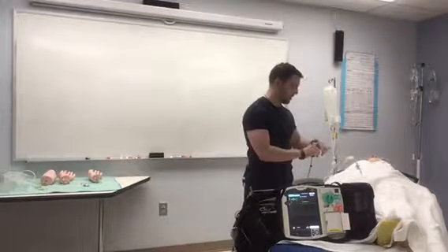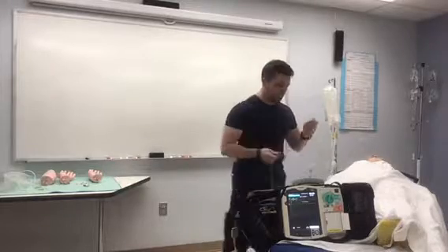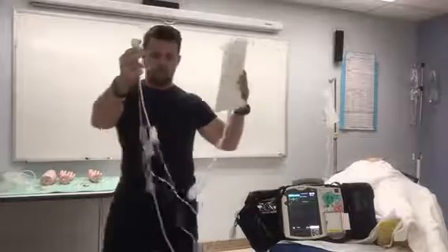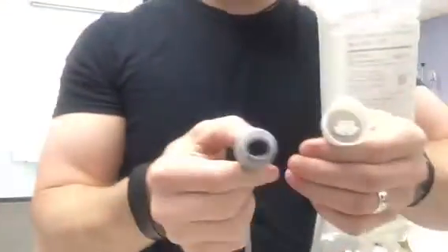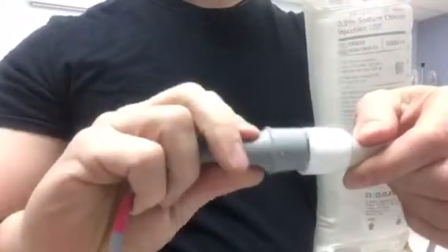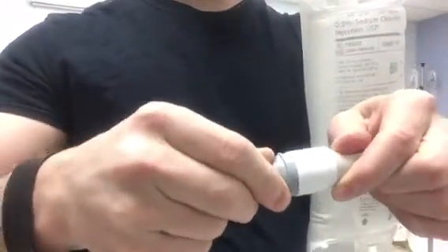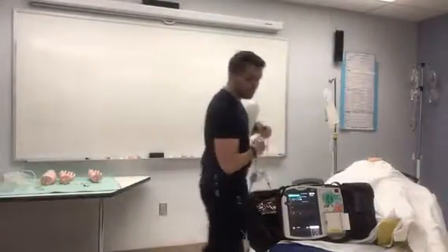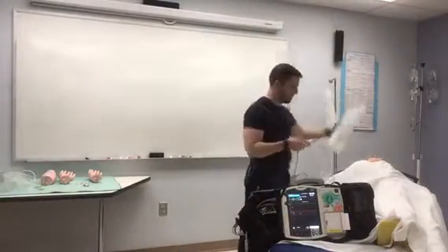My line can only go one way. It's specifically fitted so that it can only go like this. If you try to put it in upside down, it won't fit. And then once we have connection, you'll see that my monitor lights up with the flow.